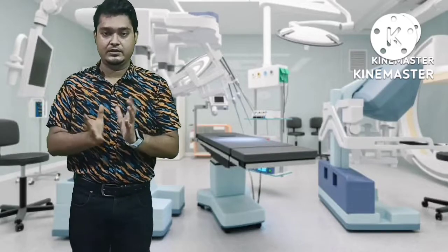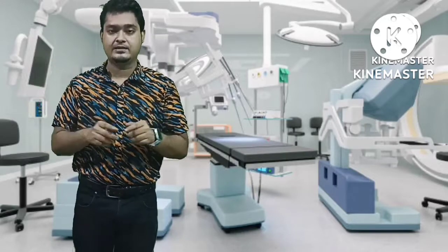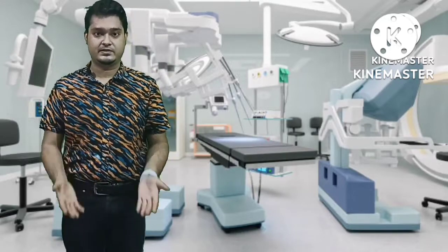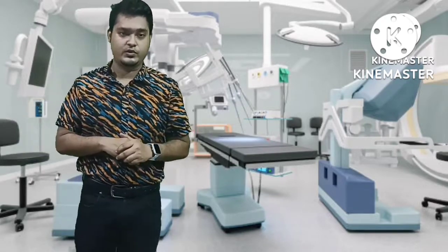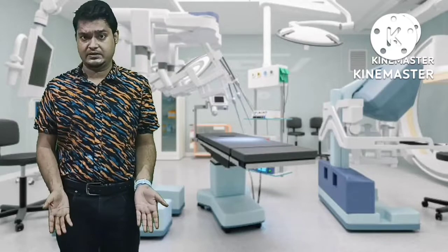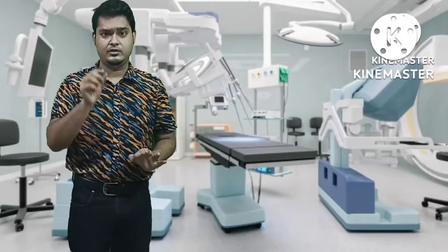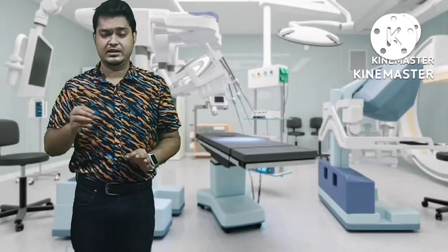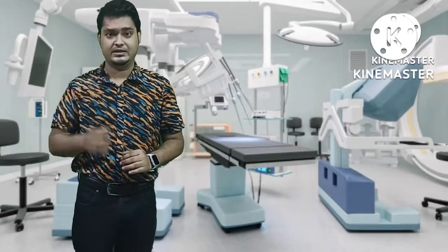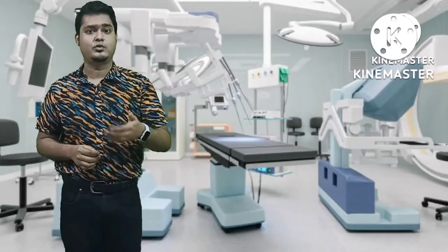After doing all these things, position the patient. A question generally arises whether we should put the patient's arms downward or upward. We can put them either way. The only important thing is to make sure the ECG leads do not move. If the ECG lead moves, artifacts will appear in the ECG graph, and the examination will not be proper.